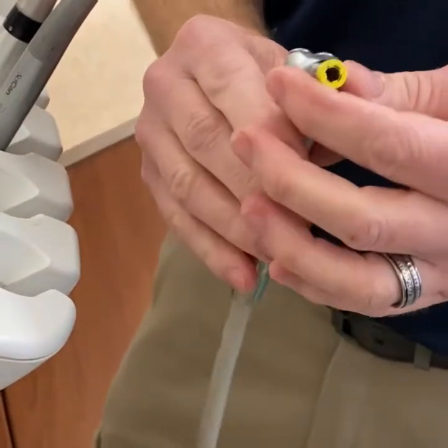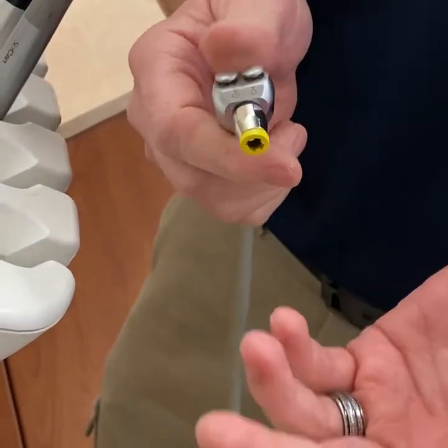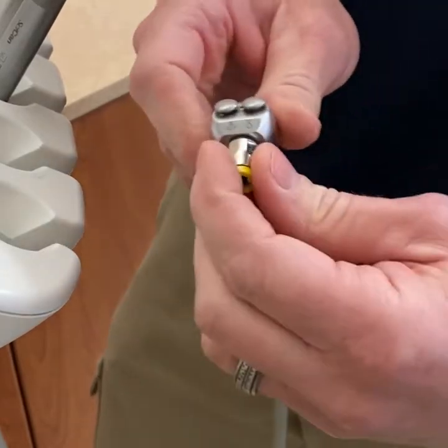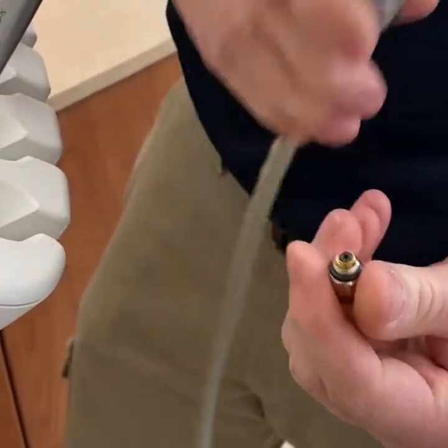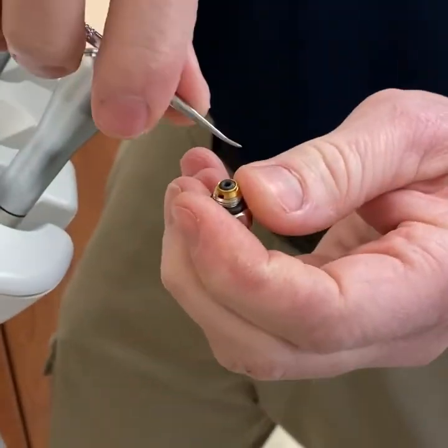For this first fix, I'm going to show you how to replace the o-ring on the syringe tip. If you push the air button and you get water coming out of the straw along with the air, a lot of times it's the o-ring underneath this syringe tip.